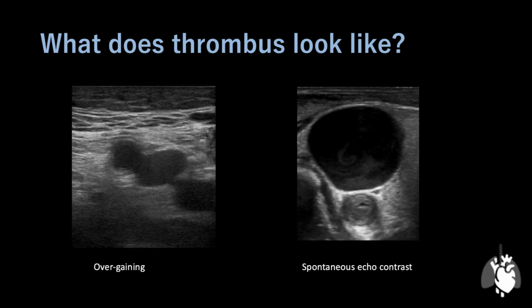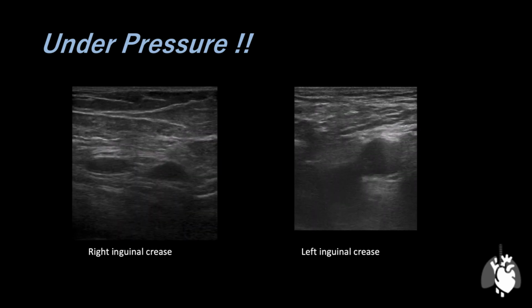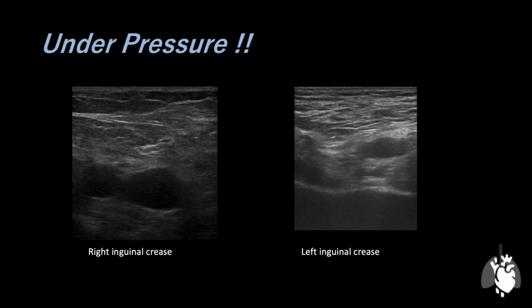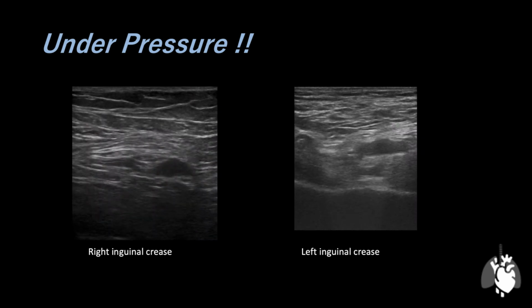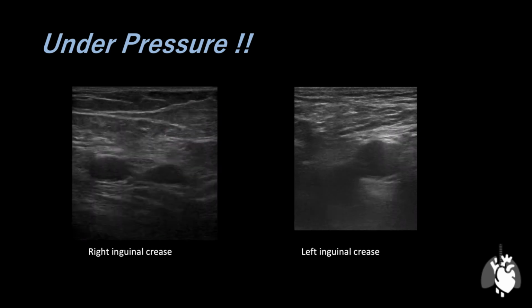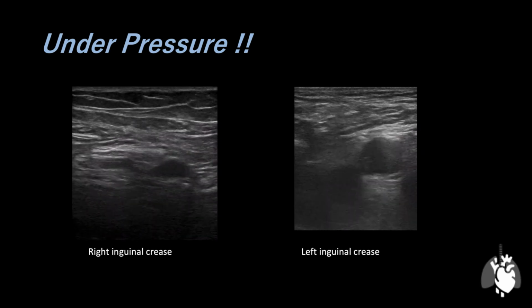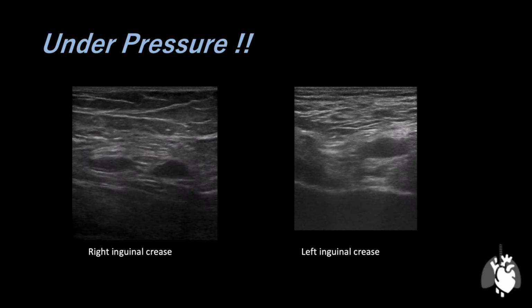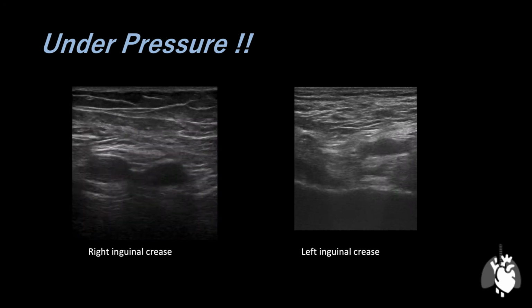So how do we detect an acute thrombus? Compression! Simply push the transducer into the soft tissue of the limb and watch the vessel collapse. Or not, if there's an obstruction such as a thrombus. How hard should you push? Well, a good rule of thumb is hard enough to compress the neighboring artery. This can be very helpful when you are trying to compress a significant amount of adipose tissue or have positioned yourself at an awkward angle.